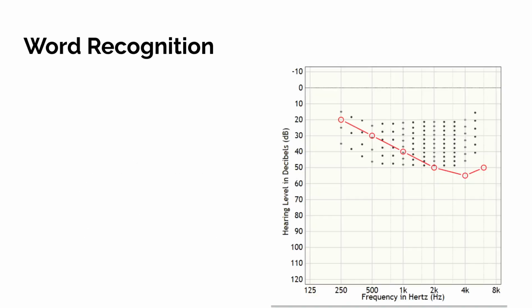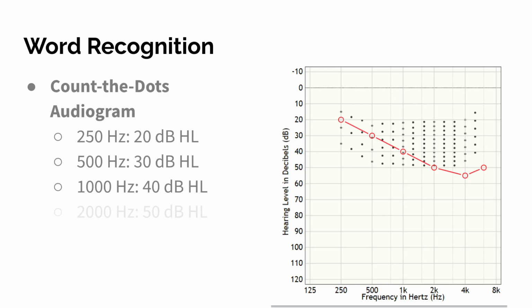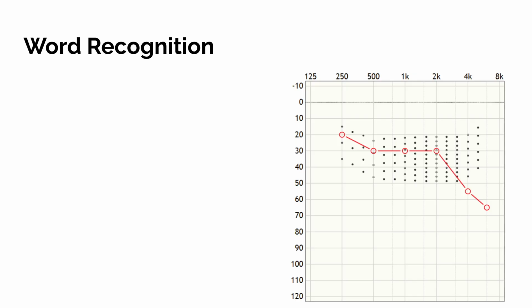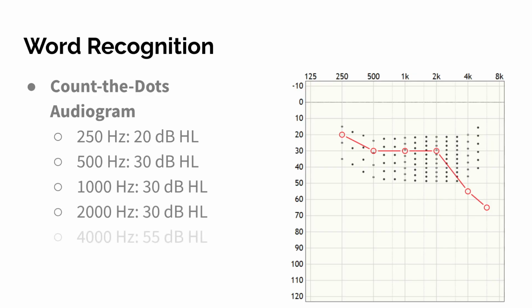So again, the dots below the audiogram here, we've got 21% below this particular audiogram, and your SII is 0.21 or 21%. Here's a different audiogram that I plugged in for the Count the Dots audiogram. It's arbitrary, but for this audiogram here, our SII value is 48%, the dots that are below the audiogram.